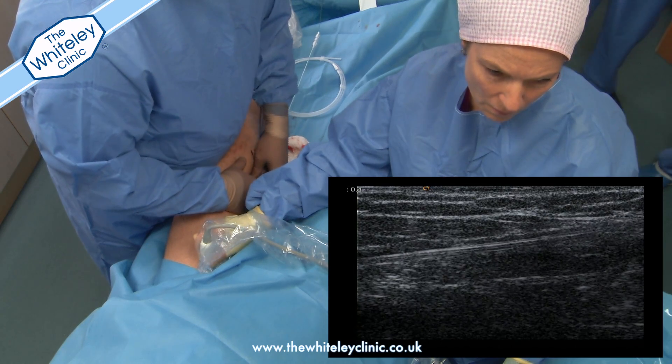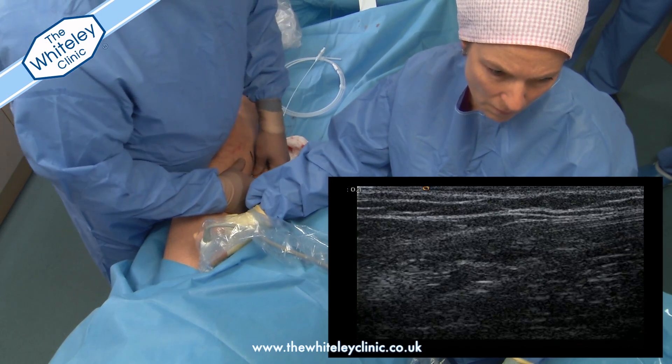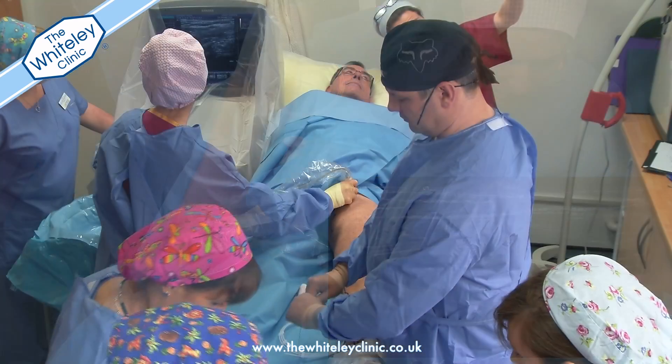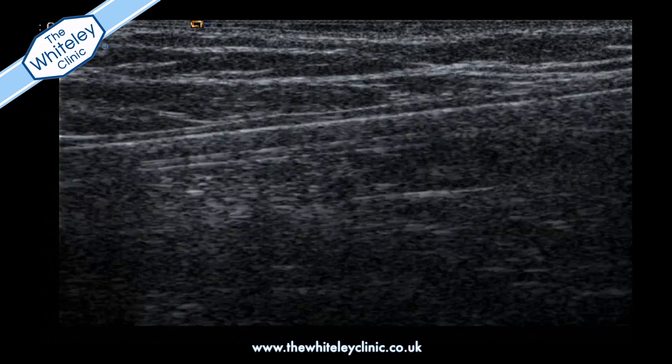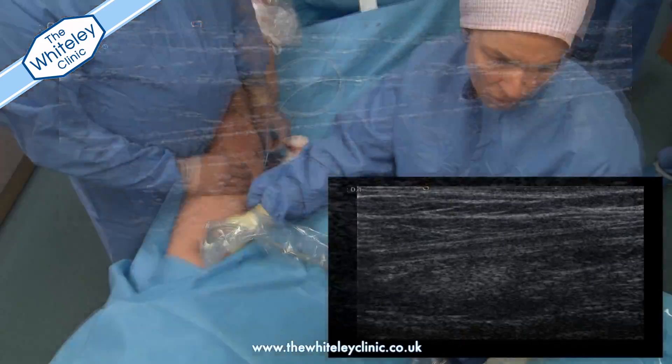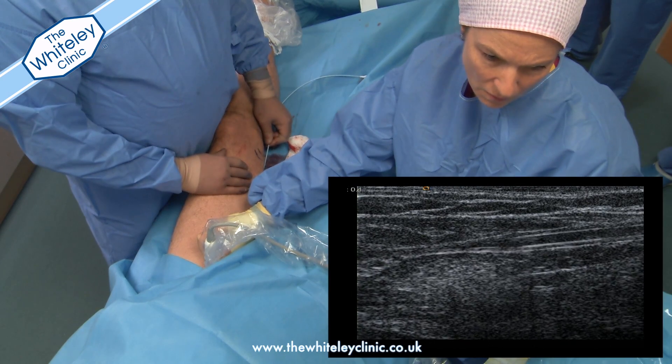Once the needle is inside the vein, it can be used to pass a very thin tube — about the size of a biro refill — all the way up into the groin. Once it's in place, the inner part of this, the wire, can be pulled out, leaving just the tube exactly where we want it, at the top of the vein.